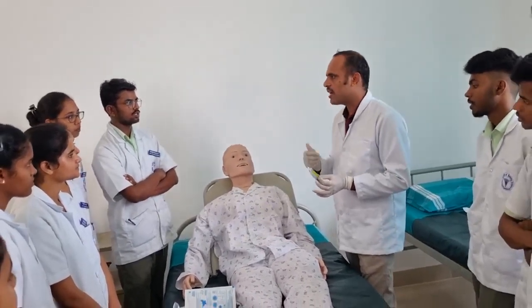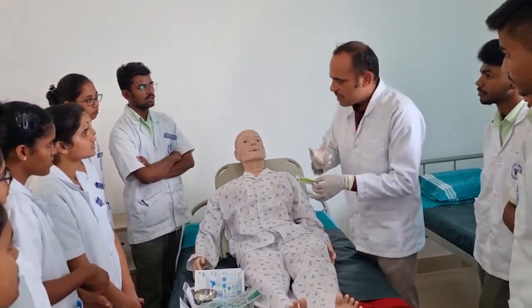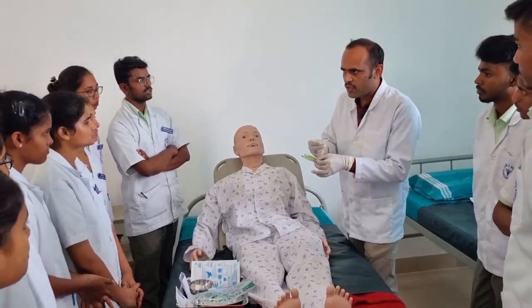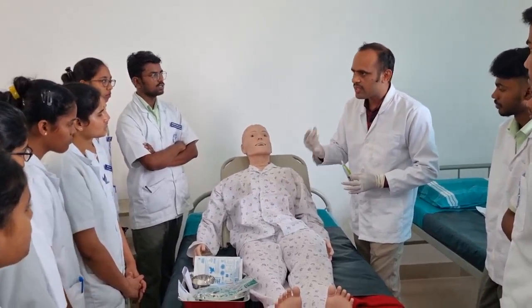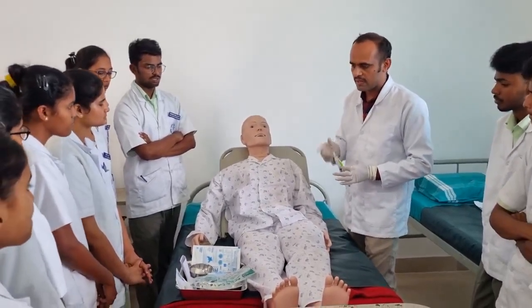So how will you identify this? If you push 5 ml of air into the NG tube, while holding a stethoscope at the stomach region, you will listen for the air sound. Okay, so that is the thing.